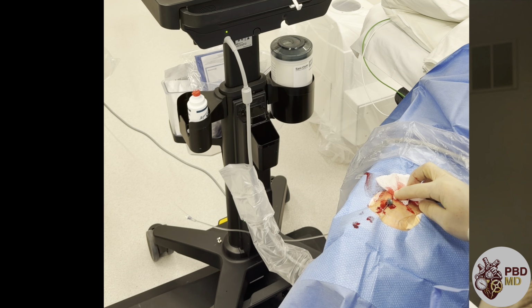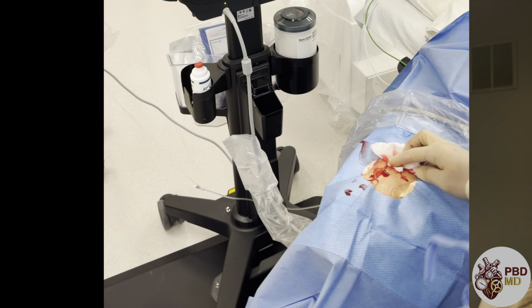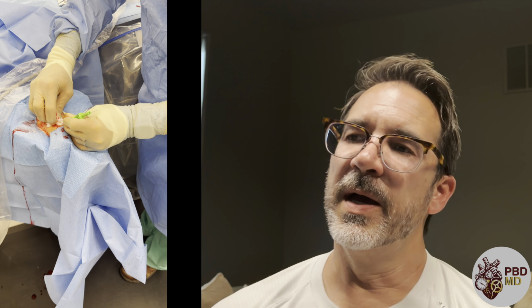Once the needle's in, we get blood flow back, and then we put this small wire, which is 18/1000 of an inch, and we switch that out for a sheath. This is what's called a 6 French sheath. 3 French is 1 millimeter, so this is a 2 millimeter inner diameter, a little bit bigger than that, maybe 2.2 millimeters in total. It's also got this, what's called a hydrophilic coating, so as it gets wet, it becomes slippery. This really helps keep it from getting stuck in the vessel.